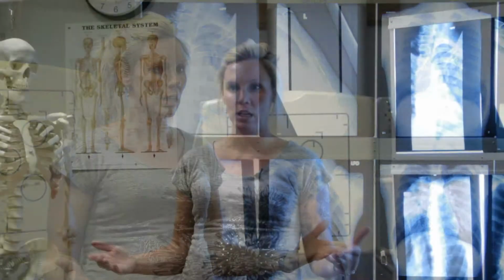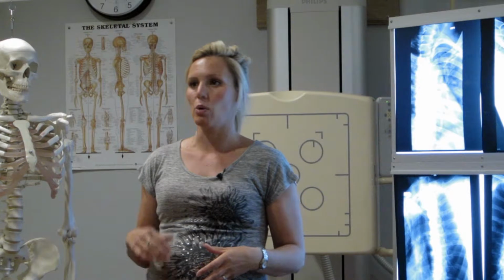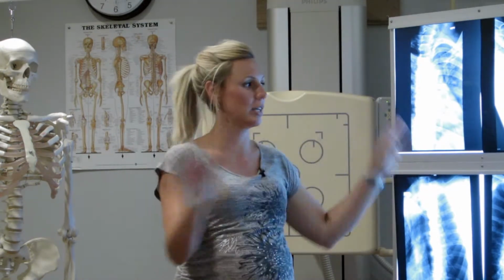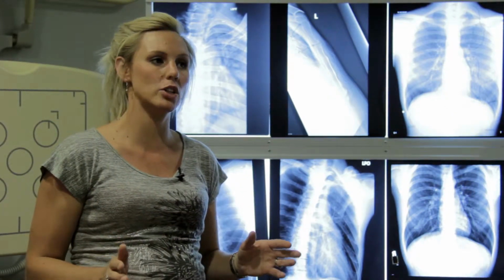we're shooting an abdomen. Now what I see happen here sometimes is patients have a really thick abdomen, so people go, ooh, we're going to need a lot more, and they go into the 90s, you know, or 95. At that point, you're creating so much scatter. They take the picture at 95 kV and they go, oh, I still am not penetrating. Oh no, you're well beyond penetrating. You're creating so much scatter, you've completely obscured the anatomy. 70 to 80 is an appropriate range for lower ribs.